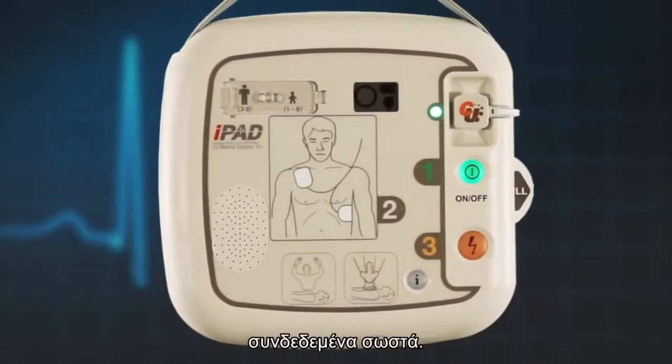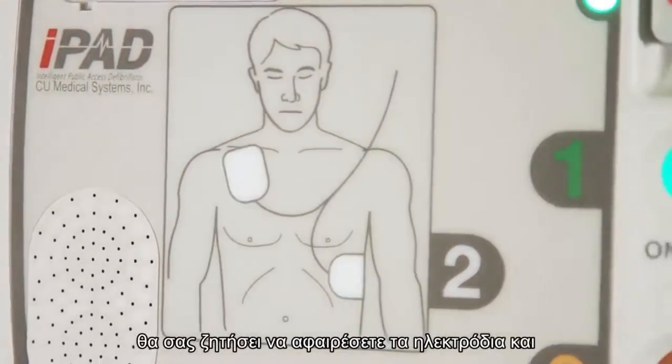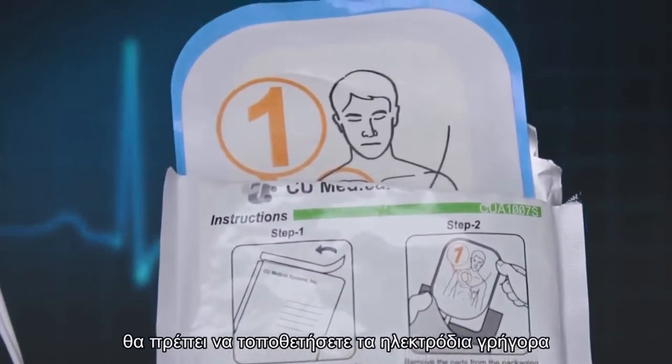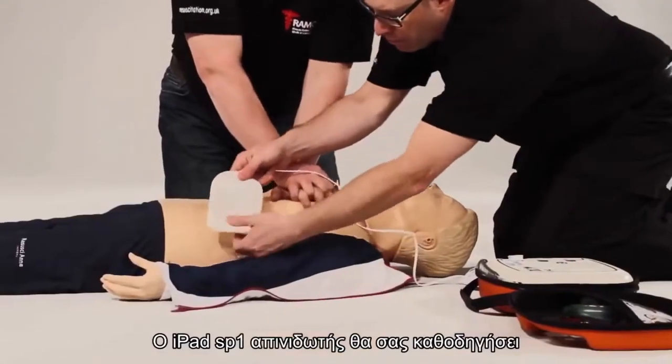The AED will then give you visual and audible prompts on what to do. Follow these instructions. The AED will prompt you to remove the pads and place the pads as shown on the pictures. Should you place the pads at a pace faster than the voice prompts, then the iPad SP1 AED will catch up with you.